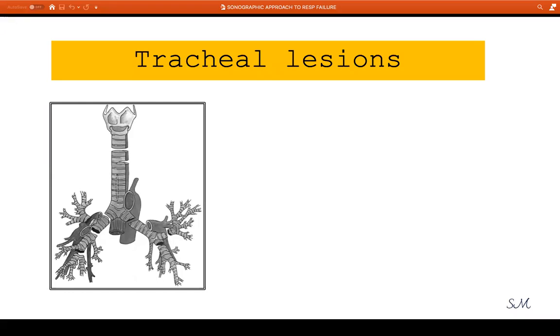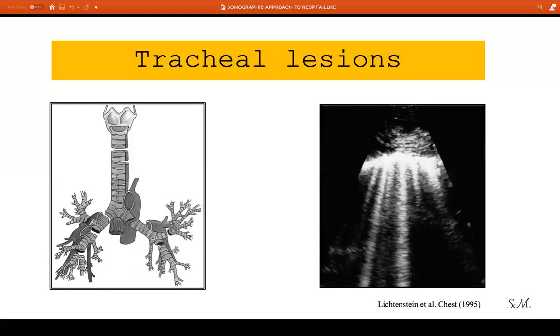In a trauma scenario, even without a pneumothorax, you can get a picture like that. If there is an injury to any air-containing lumen and air leaks into the surrounding subcutaneous tissue, you will see hyperechoic vertical lines. Those are starting from the tissue, not from the pleura, and going up to the base of the screen. And they are starting from different levels within the tissue.